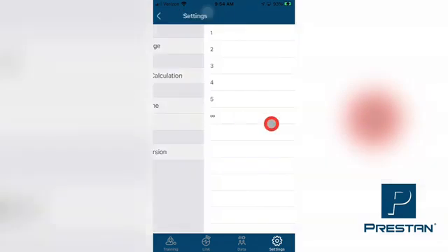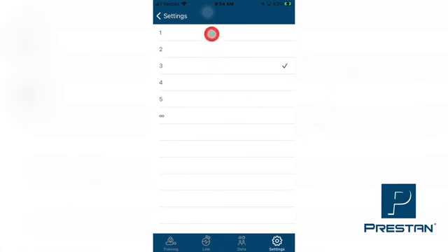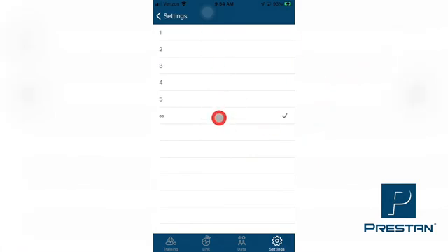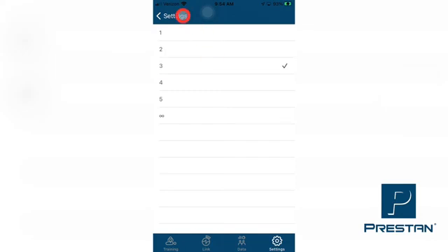Settings also include changing the CPR guidelines between the available options. Lastly, the instructor can choose how many cycles of CPR are to be completed during a simulated cardiac rescue scenario, before the app automatically ends the training and saves the data.